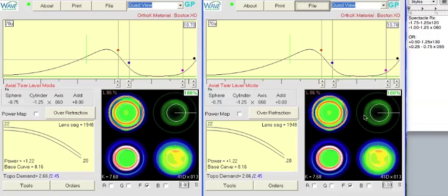So if we consider the patient's lenticular astigmatism axis 60, in this approximate meridian, the lens has a greater amount of power. So what we want to do is flatten the cornea in the same meridian so that it becomes induced with toricity in this meridian to counteract what is in the lens. And in doing so, hopefully the two will negate each other.